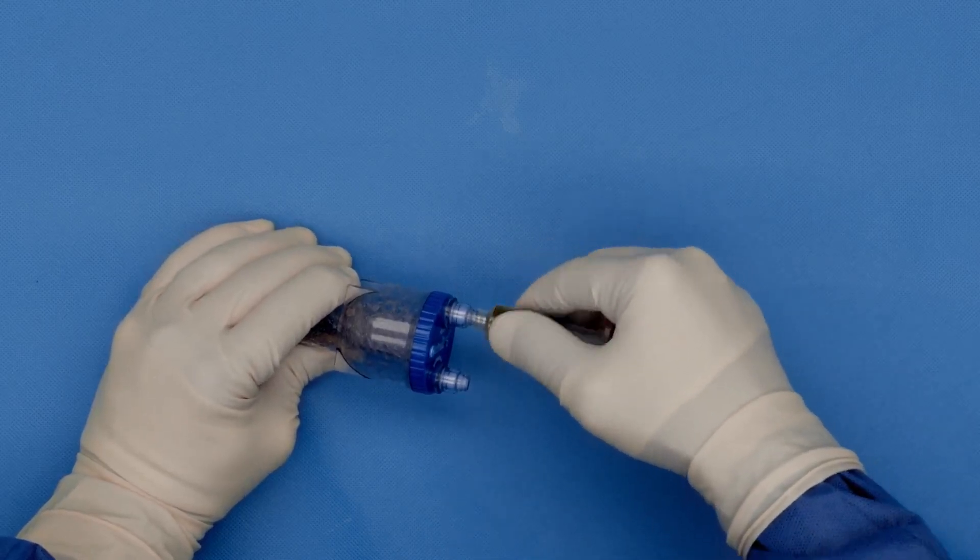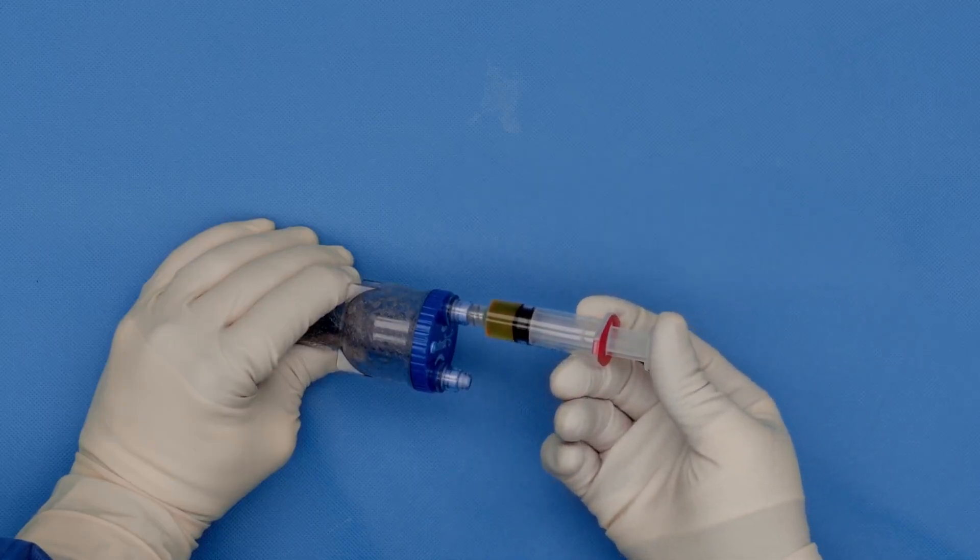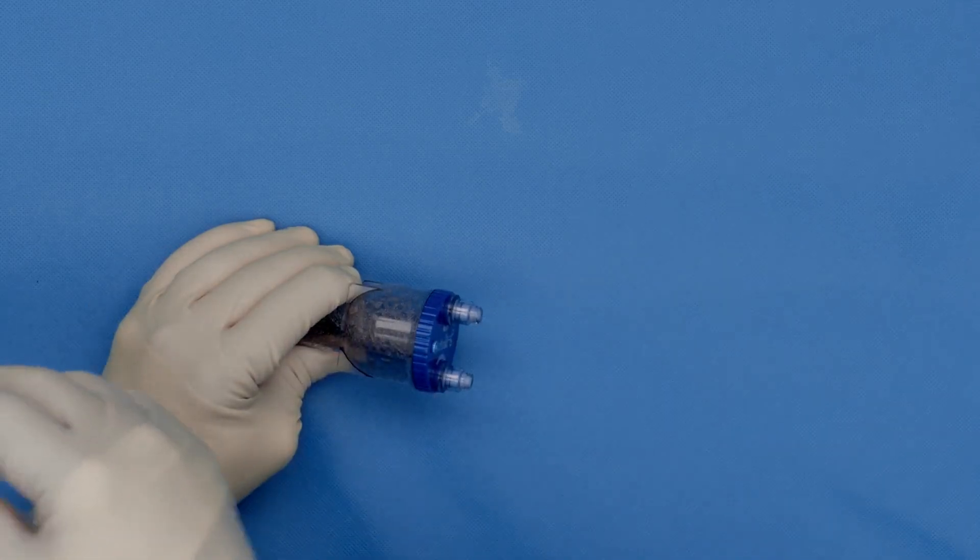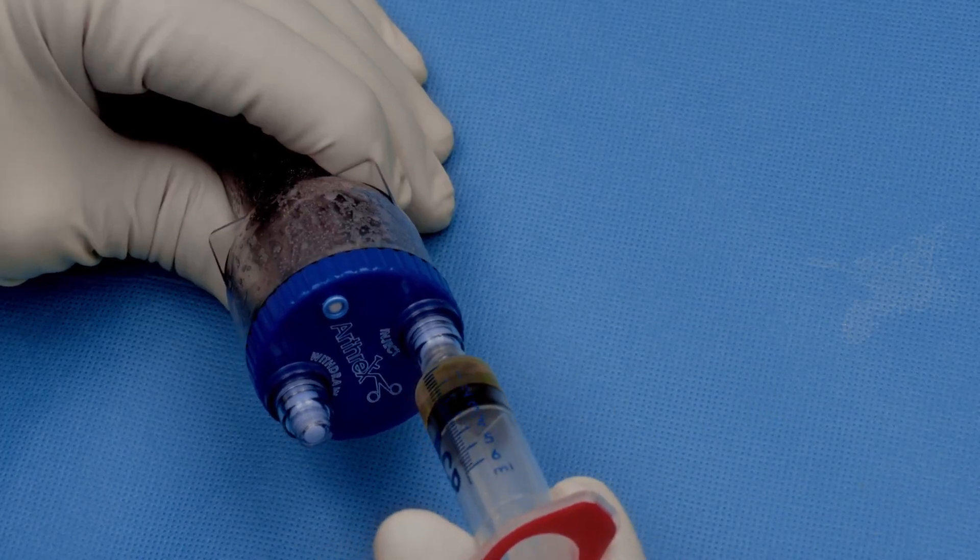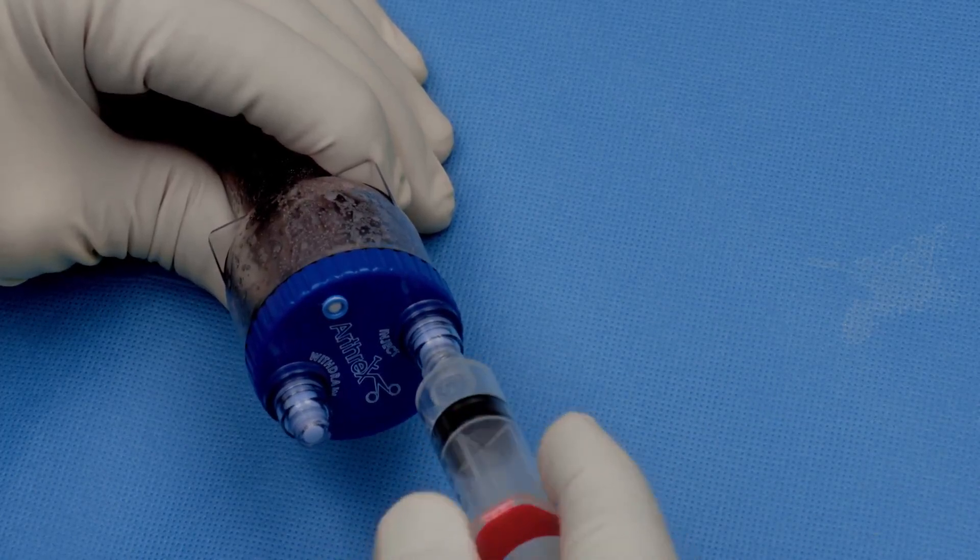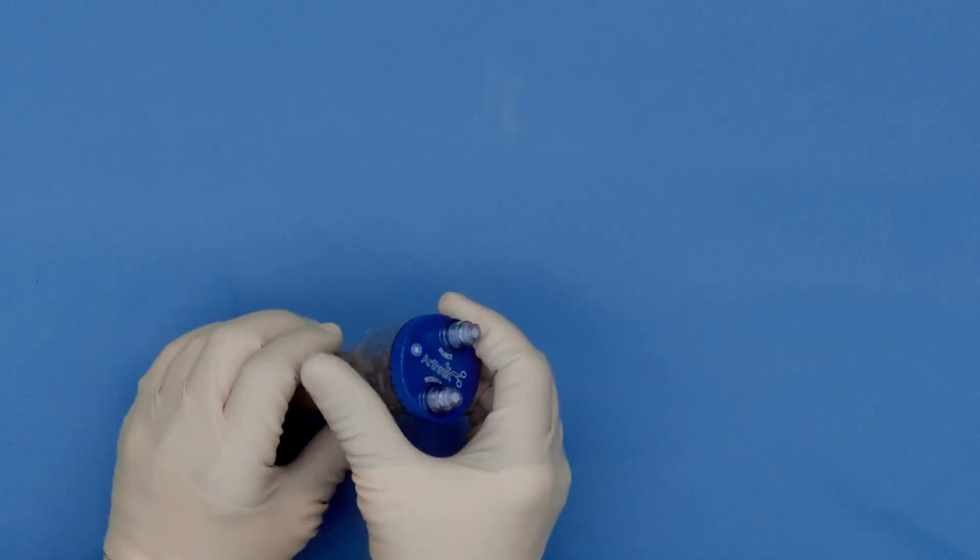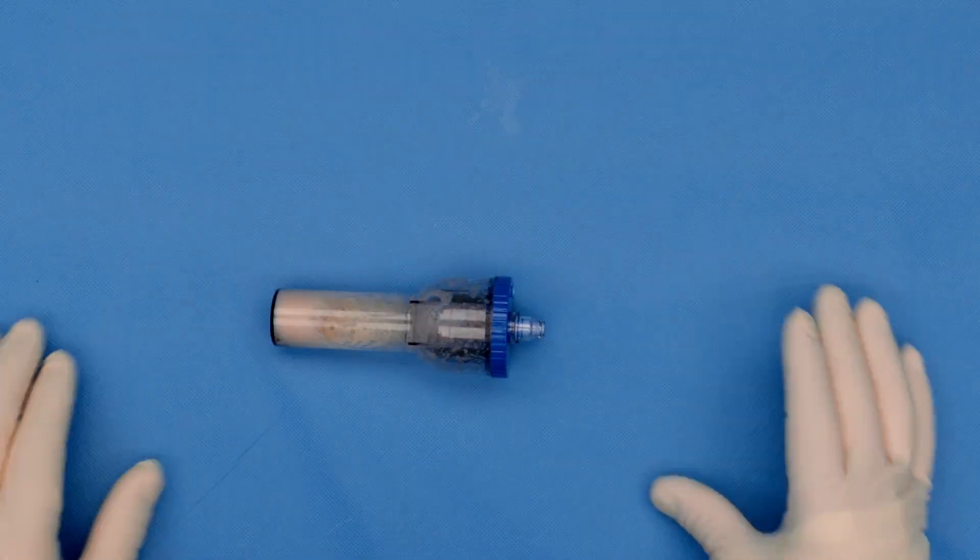After 10 to 15 minutes or after gelling has occurred, you are ready for the next step. You again connect your other ACP syringes to the thrombinator to totally inject 8 ml of ACP. And then you have to shake the device again for 5 seconds.